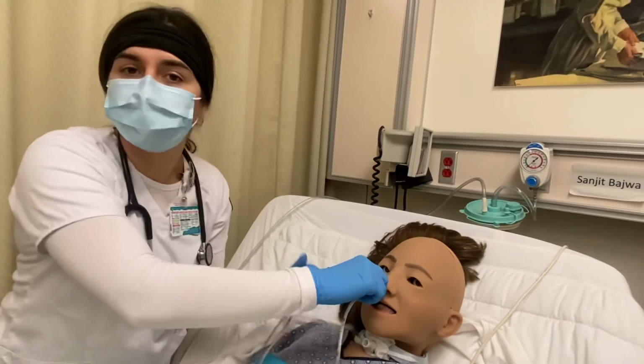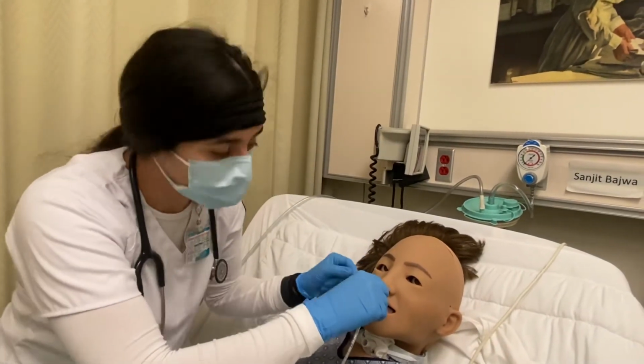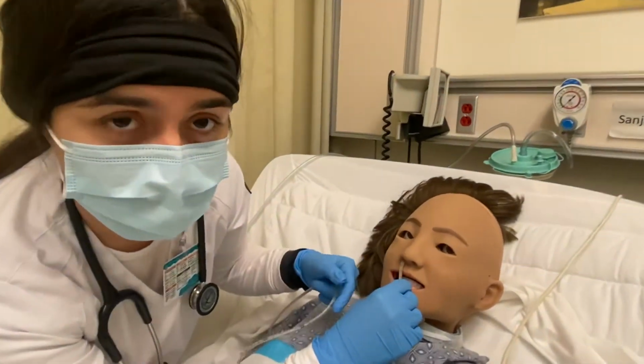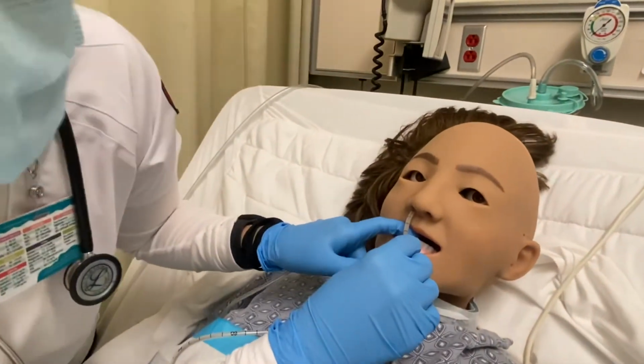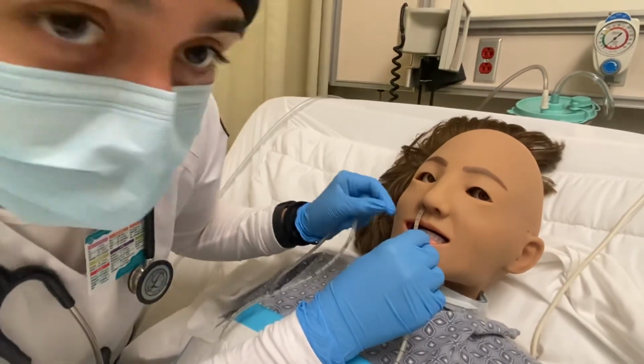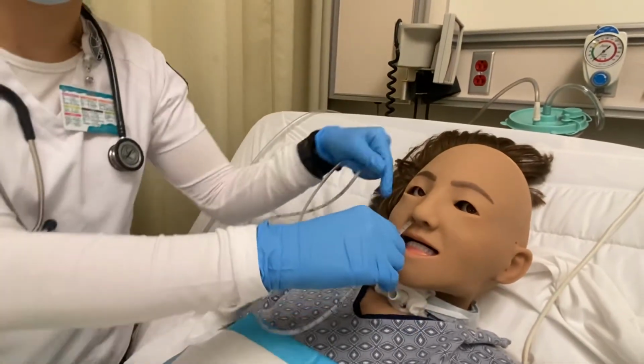If I had a flashlight, which I don't, I would double check inside the mouth to make sure it's going down. It's kind of hard right now, but I would check with a little pen light that it's going down.